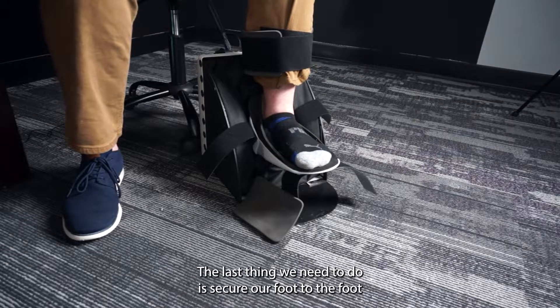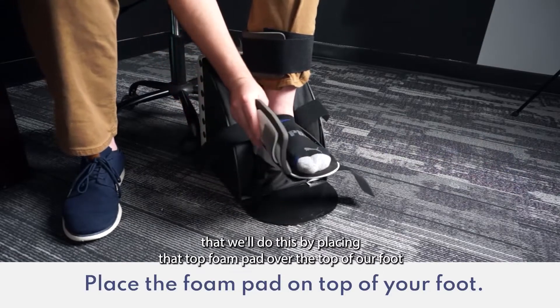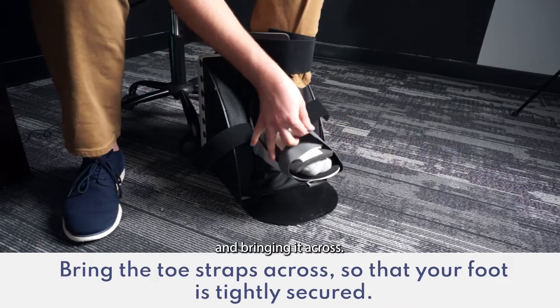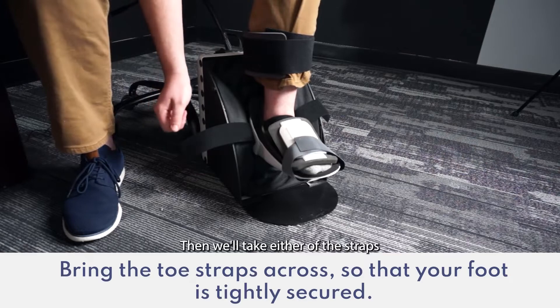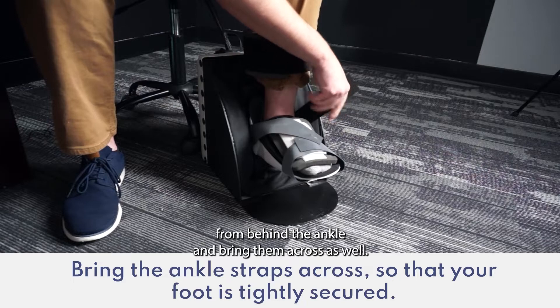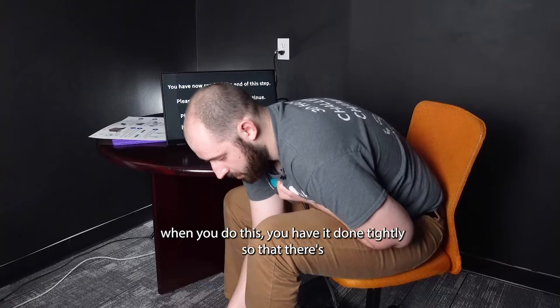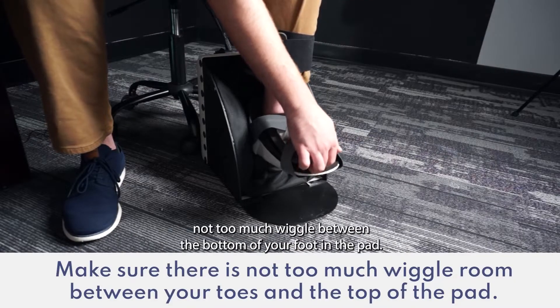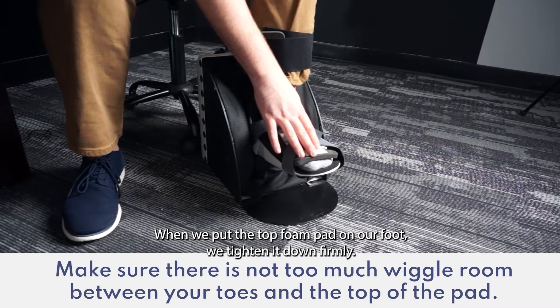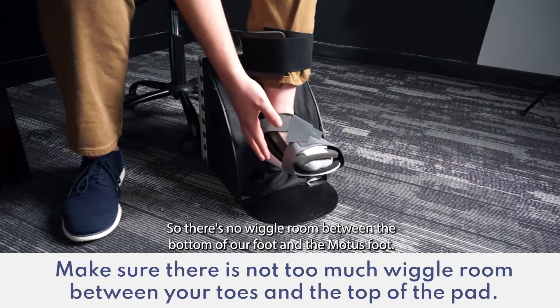The last thing we need to do is secure our foot to the footbed. We'll do this by placing that top foam pad over the top of our foot and grabbing that strap from the toe and bringing it across. Then we'll take either of the straps from behind the ankle and bring them across as well. It's important that you have it done tightly so that there's not too much wiggle between the bottom of your foot and the pad. Tighten it down firmly so that there's no wiggle room between the bottom of your foot and the Modus Foot.